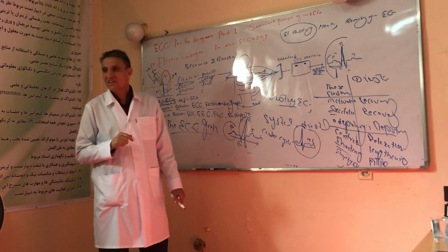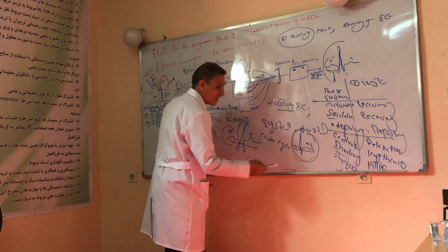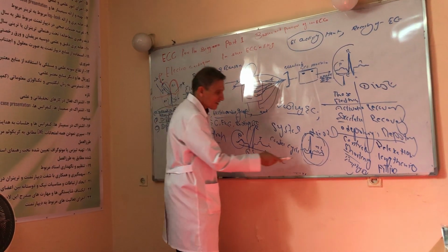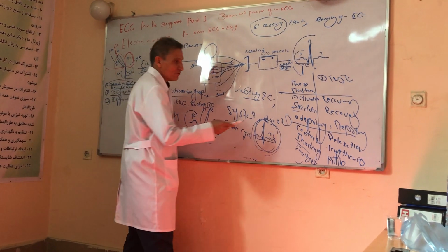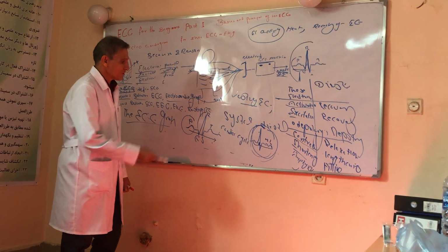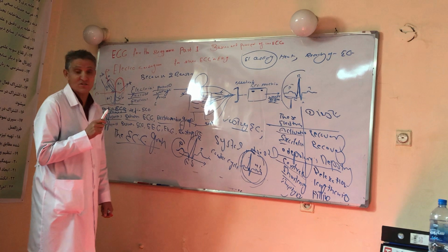What is cardiac cycle? Cardiac cycle is a rhythmic repetition of systole and diastole. This is called one cardiac cycle, or a series of waves and deflection of the needle. They produce one cardiac cycle. One cardiac cycle in the ECG is shown by this pattern. When we are talking electrically, we should think about the activation. Or when we are talking mechanically, we should think about the contraction. This was about the definition of cardiac cycle and those electromechanical terms which represent systole and diastole.